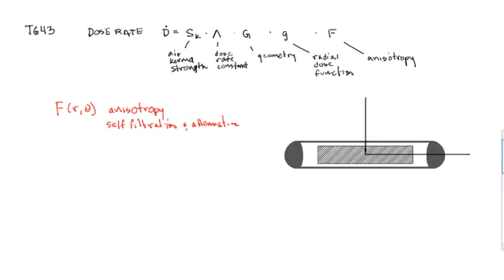Here's a seed, one of the old iodine seeds. As you go out some distance along here, you'll see it penetrates through the shell of the source, right? As you go at different angles, it's penetrating through different distances through the source itself and the shell. And so you get more attenuation as you go out along towards the tip of the source. That's self-filtration.